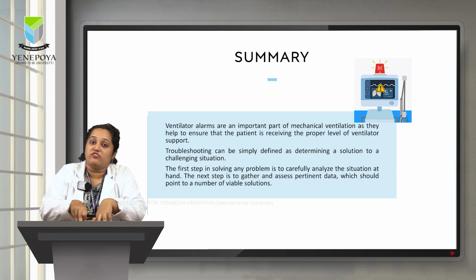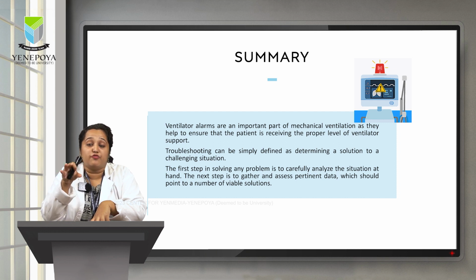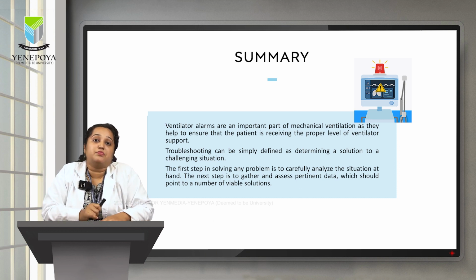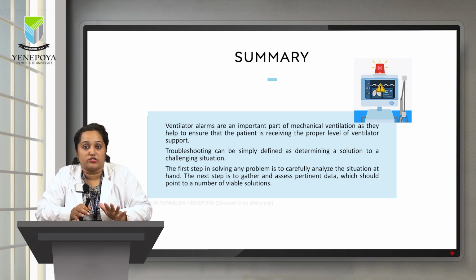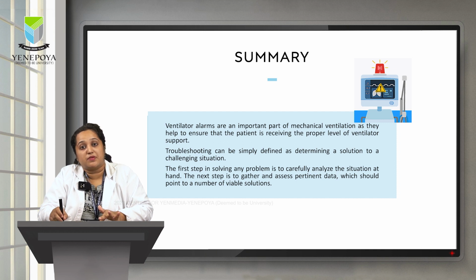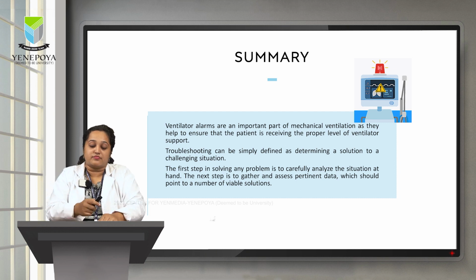So overall I would like to say, whatever alarms you hear, definitely you need to go and troubleshoot them rather than just silencing them, because if you silence the alarm, it might cost that patient's life. The first step in solving any problem is to carefully analyze the situation at hand. The next step is to gather and assess the data, which should point to a number of viable solutions. If you are not going to the patient bedside, you are not going to know what is causing it. But if you go to the bedside, definitely you will find n number of reasons because of which the alarm might be there.